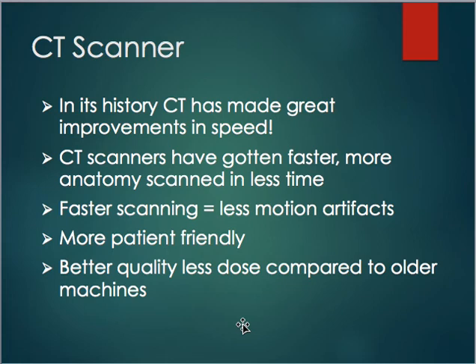So if we can take those slices and each slice is only as thick as a credit card, that means we can find very small cancers very early so that we can help treat those patients sooner, before those symptoms become big and they stage later, where it might not be as easy to cure.